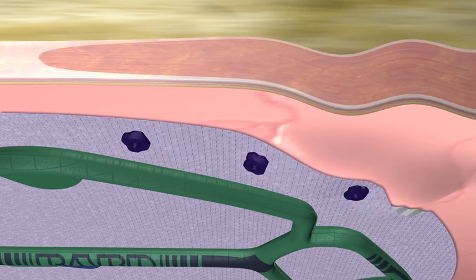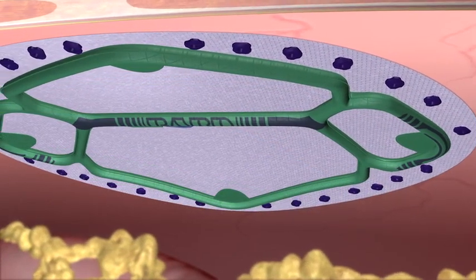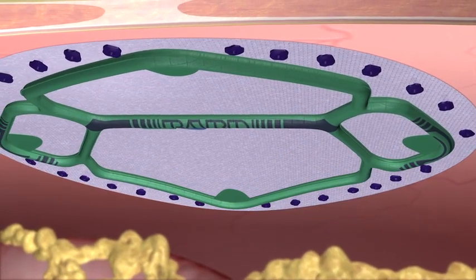Fasteners should be placed every one to two centimeters around the entire mesh perimeter before deflation and removal of the ECHO-PS Positioning System.